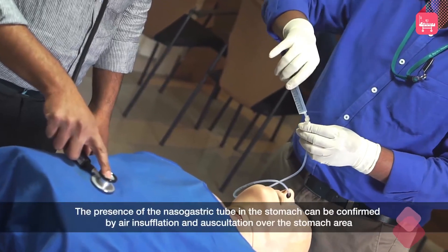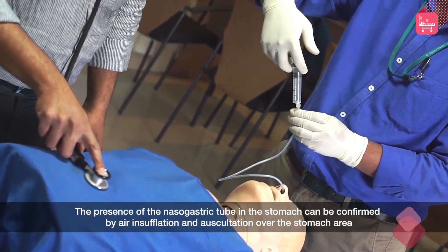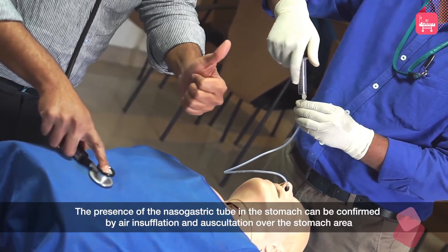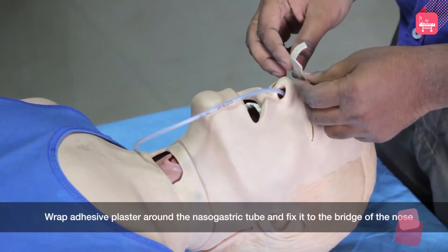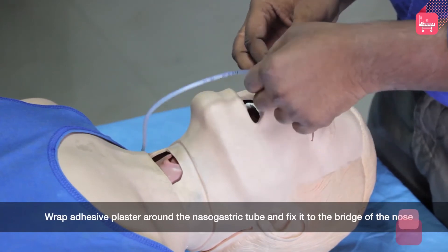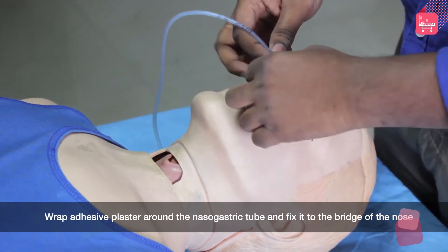The presence of the nasogastric tube in the stomach can be confirmed by air insufflation and auscultation over the stomach area. Wrap adhesive plaster around the nasogastric tube and fix it to the bridge of the nose.